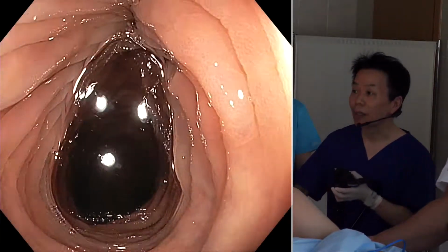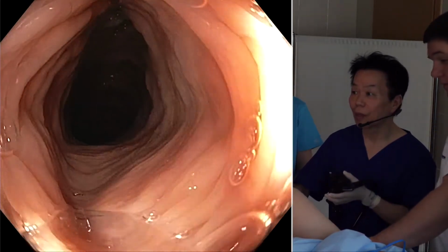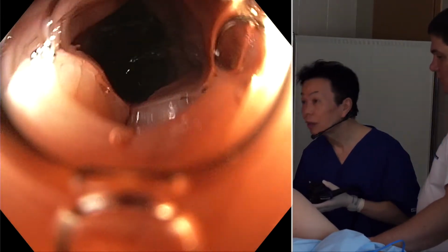I don't recognize any polyps so far. Have you? Maybe not. Oh, we have run out of CO2. No? Just stop it.